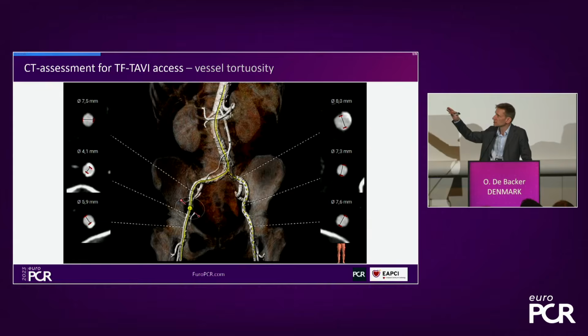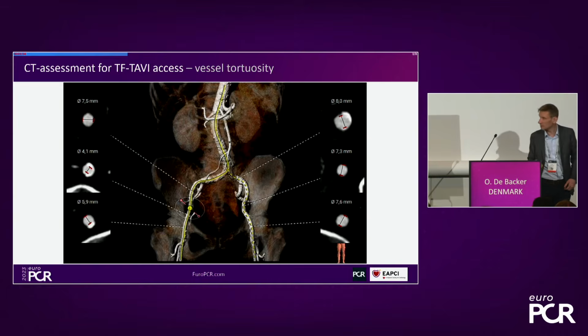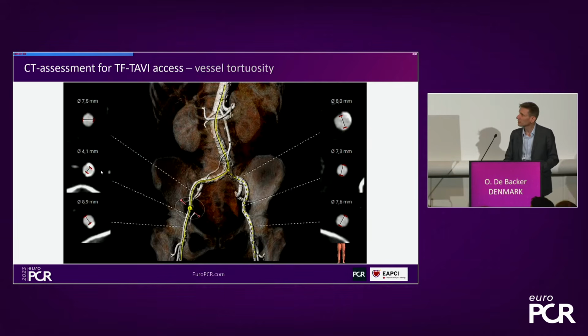So what you do is you look at tortuosity first. Is there anything particularly tortuous, the left, the right, which maybe pushes you to do the case on the left or the right side? I think here they're equally non-tortuous. There's hardly any tortuosity. You already see that on the left side there is, maybe if there is a pointer here, or I can maybe do it on the screen here.